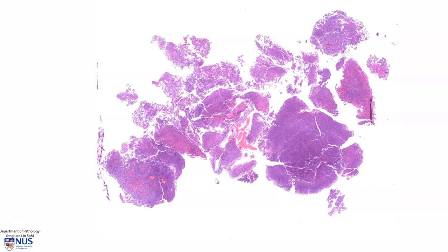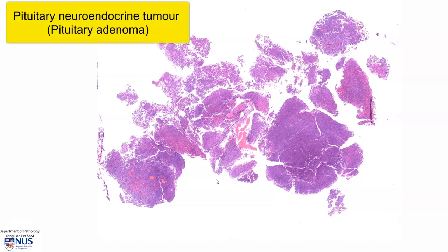This is a virtual microscopy slide of a pituitary neuroendocrine tumor. The older nomenclature for this tumor is pituitary adenoma, so these two terms are interchangeable, with the current term being pituitary neuroendocrine tumor.